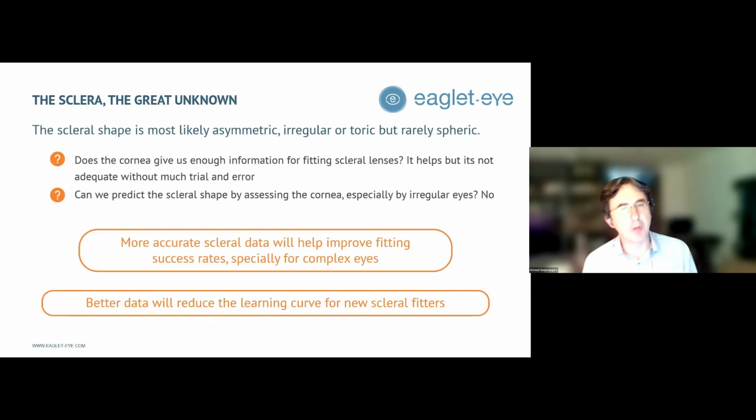Because a good question to ask yourself then is, if you have full cornea data, can you actually extrapolate from that and fit a scleral lens? Well, the answer is that if the cornea is not too irregular and the keratoconus not too advanced, then it will help, of course.